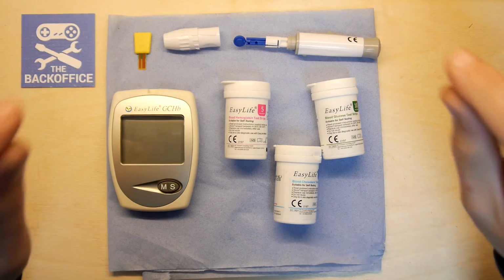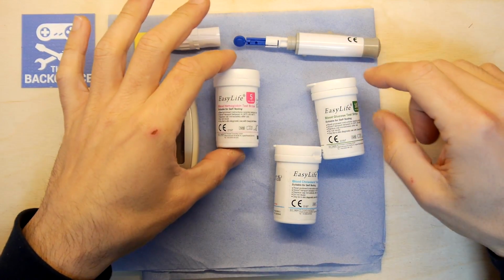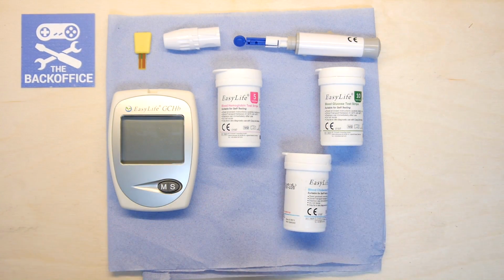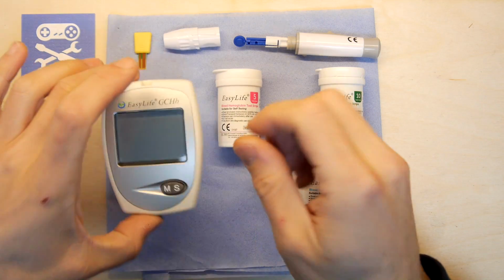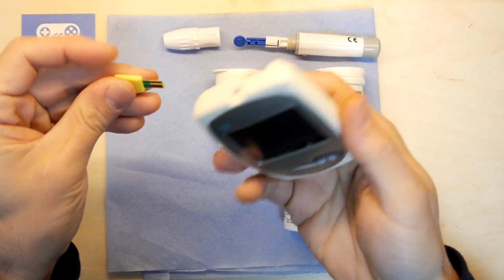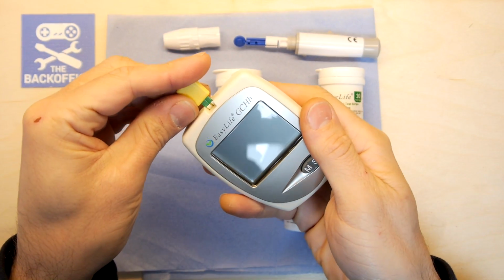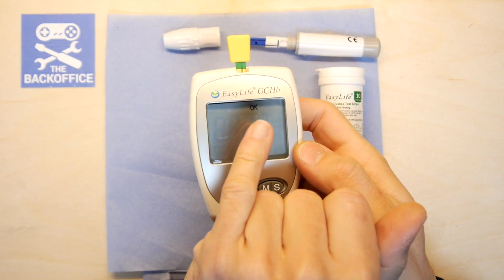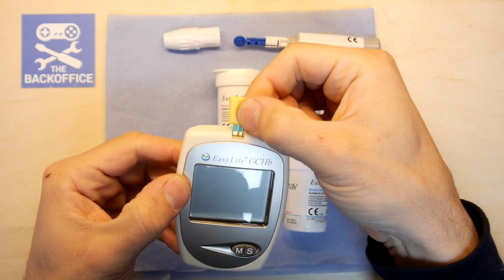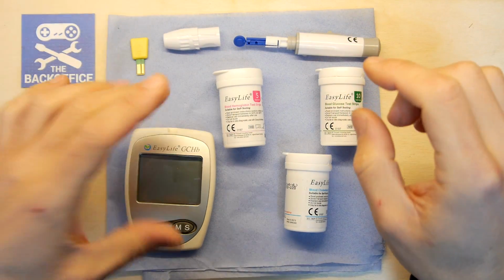I'm back. I've read the instructions and laid out now everything that I'm going to need. This is the hemoglobin test, blood glucose test, and blood cholesterol test strips. There is an interesting feature in this meter because when you put new batteries in or drop it, or any time you think a result is suspect, it says take this and pop that in there, and it's like a checking thing. And if it says OK, then the meter is happy. So it's obviously measuring the resistance in here, which is like a calibrated resistance for it. That's kind of cute. I like that.